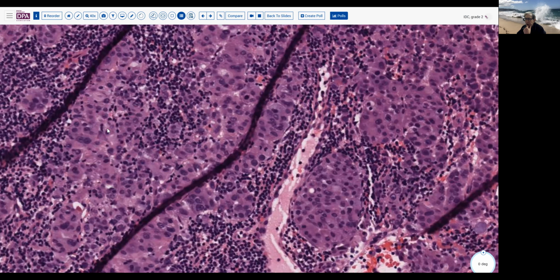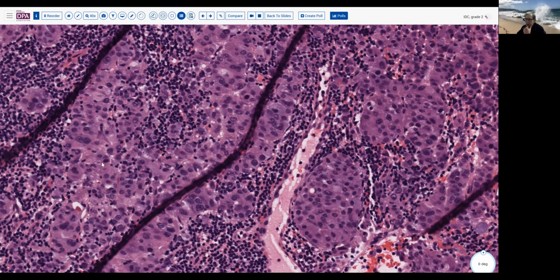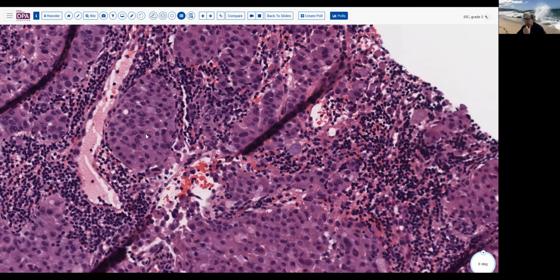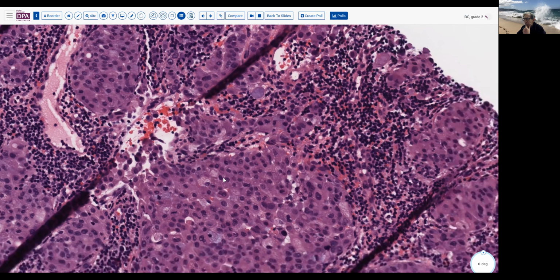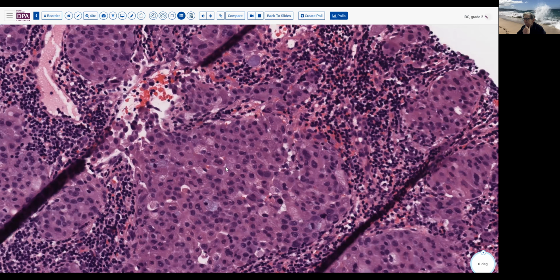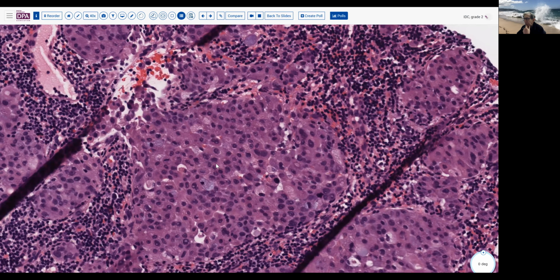That said, you can give an idea of whether it's well or poorly differentiated based on gland formation, based on nuclear features and mitotic rate. And so you may choose to use those terms if you desire in an isolated lymph node. In general, we get lymph node biopsies often concurrent with breast biopsies. And when we report the lymph node ductal carcinoma or whatever, we will generally just report metastatic carcinoma as present, consistent with breast primary, and leave the grading and so forth to the breast biopsy itself.